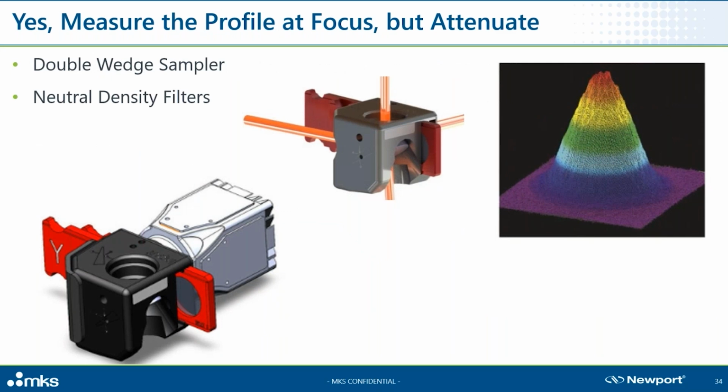So yes, we need to measure the profile at focus. But first, we knock the power down to safe levels. We recommend a double wedge beam sampling system to maintain polarization while profiling a small sample of your beam.